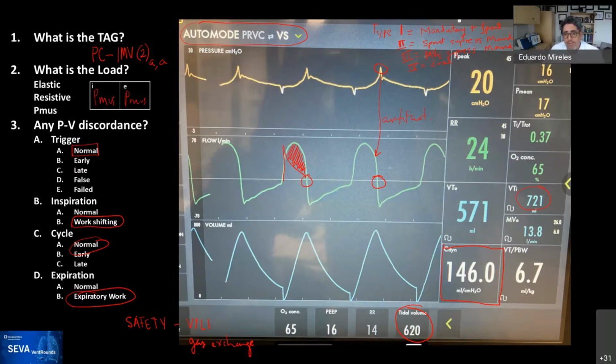So even though the peak pressure may not look very high, it's possible that the patient is generating more transpulmonary pressures in certain regions of his lungs. That could be an issue. So I would pose that, especially now in these days of P-SILI being on our radars again, we could potentially do something different with this.